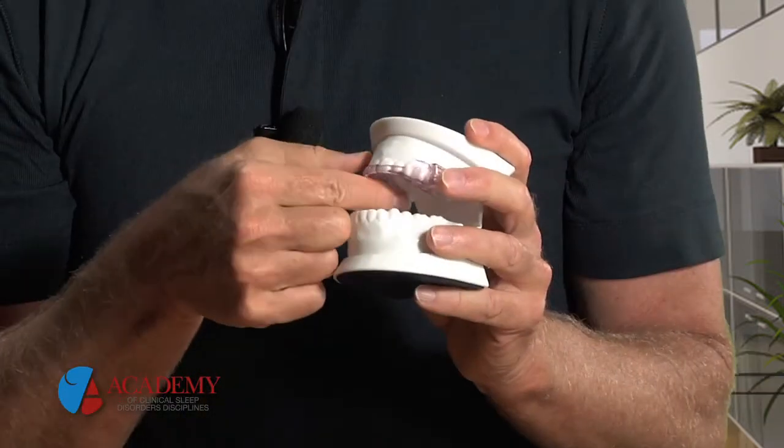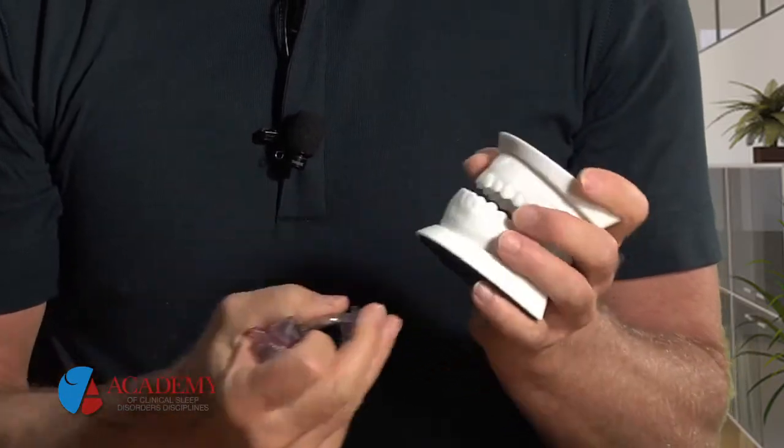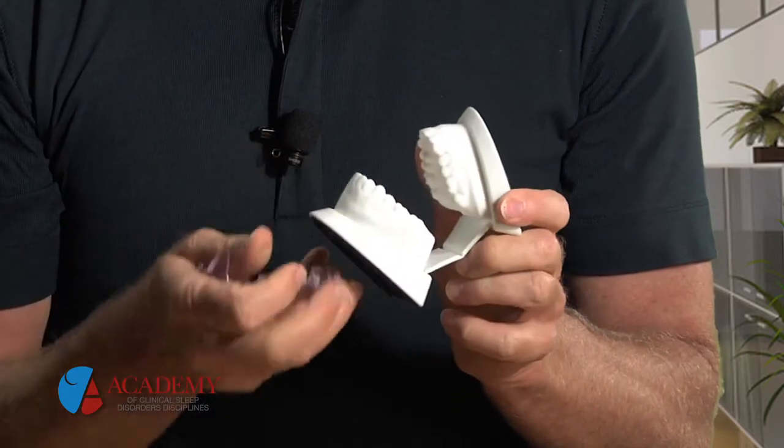They'll all have two components to them, one that will fit over the lower teeth, one that will fit over the upper teeth. And again, we're looking at a jaw position where we want to stabilize that and not allow the lower jaw to drop back.